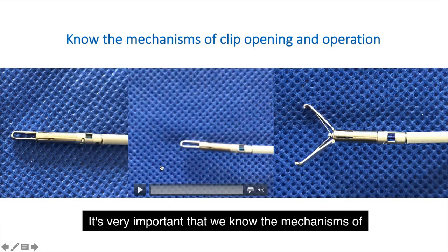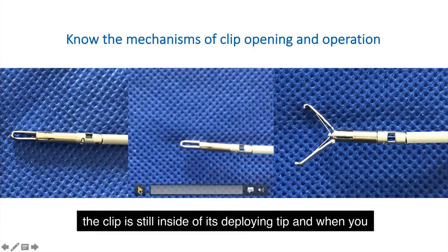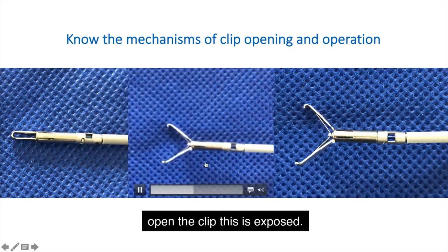It's very important that we know the mechanisms of clip opening and operation. Observe here how part of the clip is still inside of its deploying tip, and when you open the clip, this is exposed.